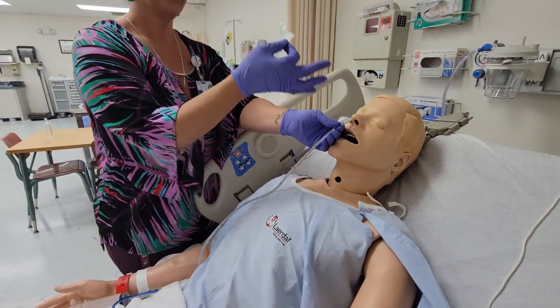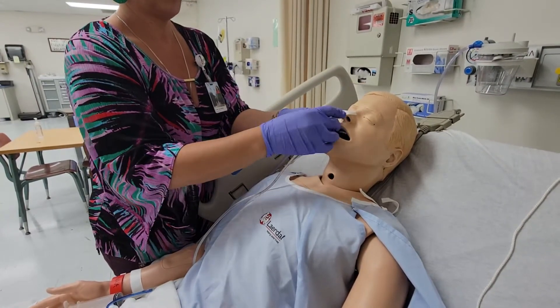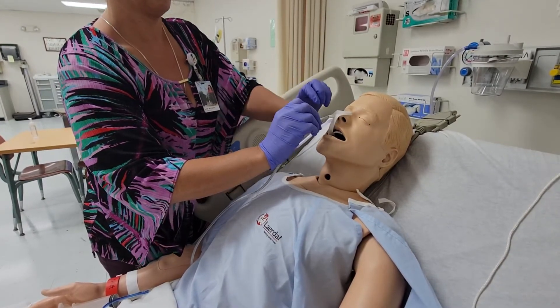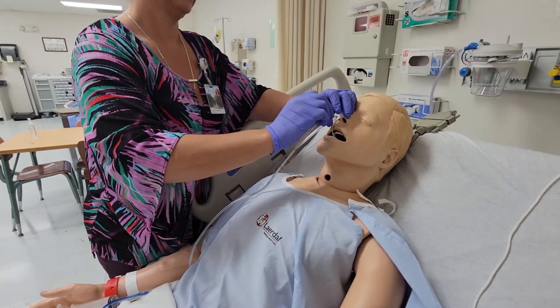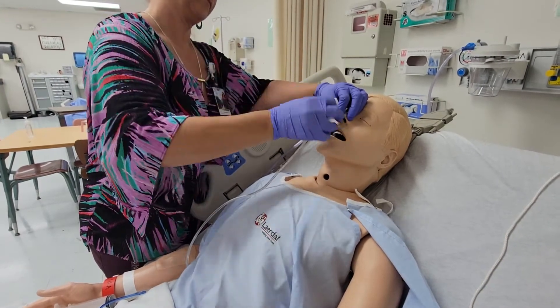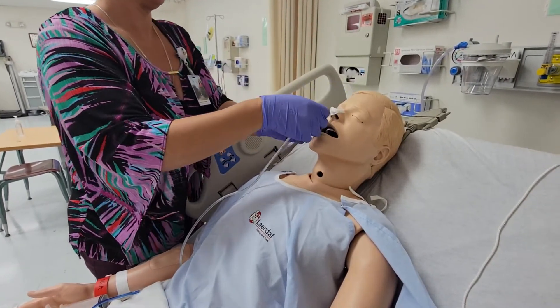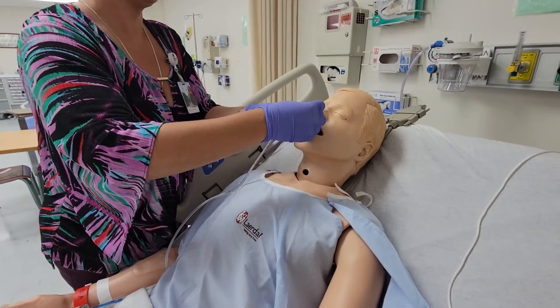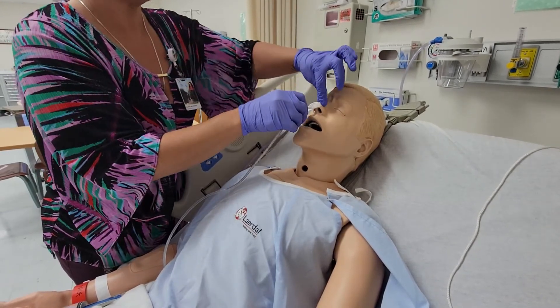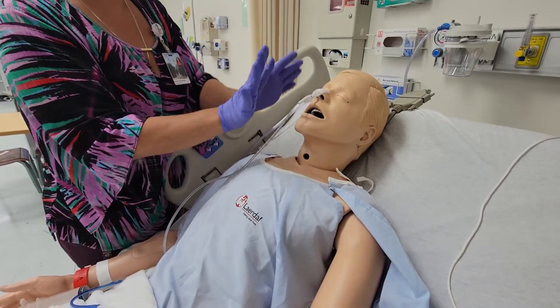Do not ever let go of your tube because it will shoot out. Take your blue jeans tape, place it on the bridge of the nose, and wrap it around. When you secure it, make sure the tubing is not rubbing against the nare because it will cause skin breakdown — you want it just in the middle. Now we're secured and you can let go.